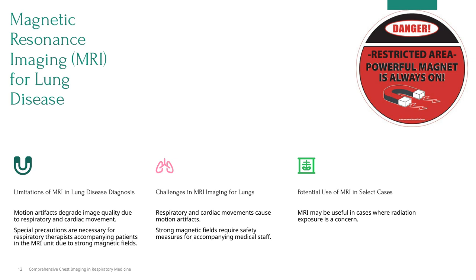It's not always the first choice, but in specific situations, it can provide crucial information without the risks associated with X-rays or CT scans. Overall, while there are hurdles to overcome, MRI remains a useful tool in our respiratory medicine arsenal, especially when we weigh the benefits against the limitations.